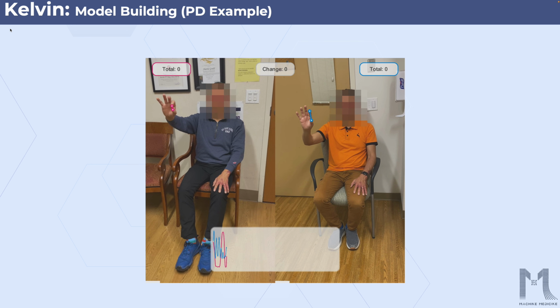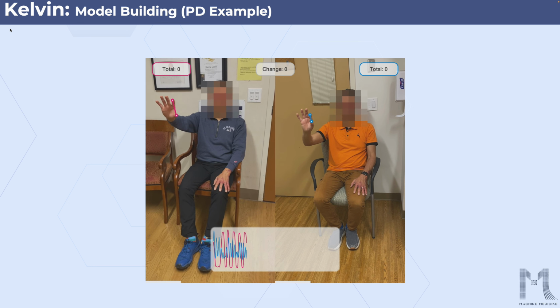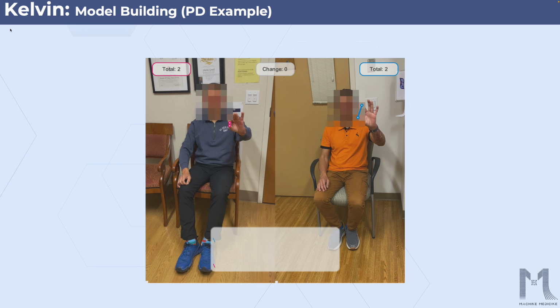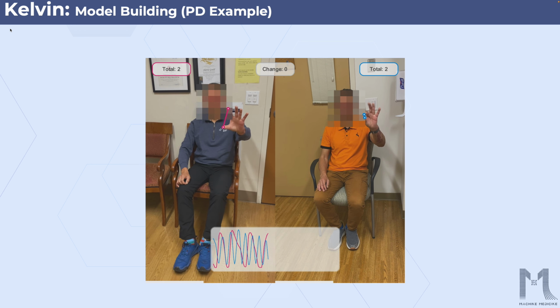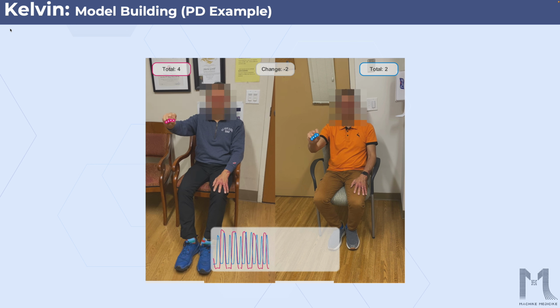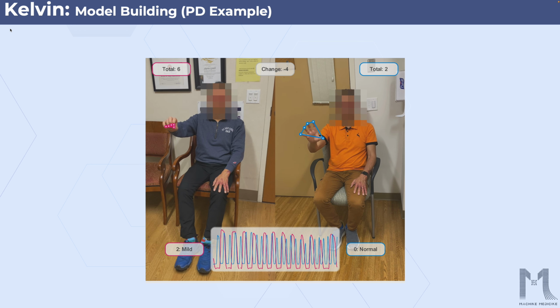And what we're doing here is we're using our kinematic analysis, which has been based on a model trained through the Barlow framework that I described, where we fine-tuned it to assess PD symptoms in particular. And what we're showing here is that algorithmically the model is able to detect the difference between the patient's clinical condition pre-surgery and the patient's clinical condition post-surgery.